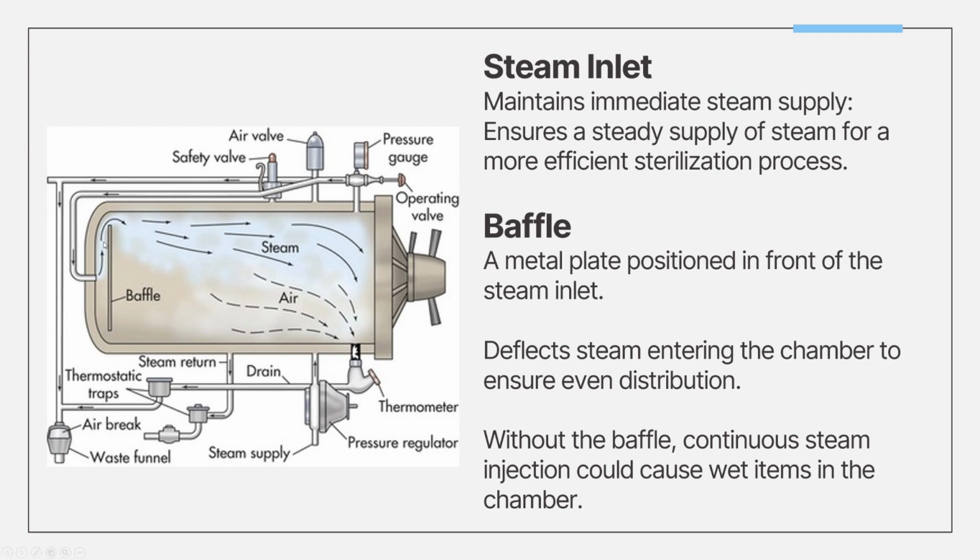And now we're going to look at the baffle and how it works. So the baffle, as you can see here, because steam is hotter, it rises, right? It's hot air. It rises from here. Otherwise, if the baffle is not here, the steam is just randomly being thrown about. And for the most part, the devices placed here will probably get the brunt of all of that steam, right? And it will most likely get wet. So the baffle makes it so that the steam has a more gentle entrance to the chamber itself, so that it's not just focusing on that one poor medical device that was placed here on this level.